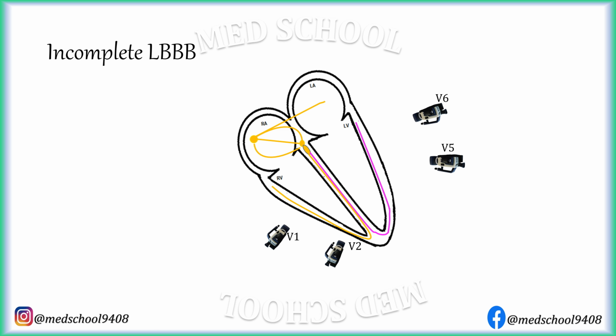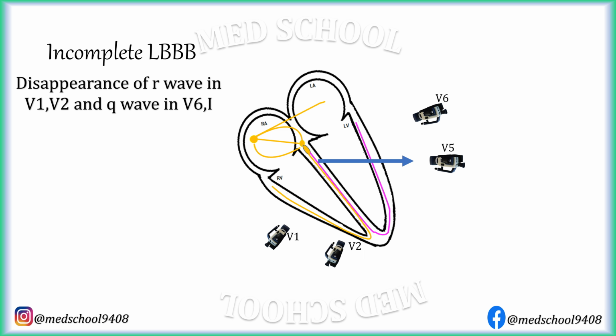In incomplete LBBB, conduction through left bundle branch is not completely blocked, but only slowed. As you already know, septal fibers arise from left bundle branch. Hence, septal activation is delayed. Hence, septal and left ventricular activation occur at same time. As there is no separate septal vector, first sign of incomplete LBBB is disappearance of R wave in right-oriented leads and Q wave in lateral leads.